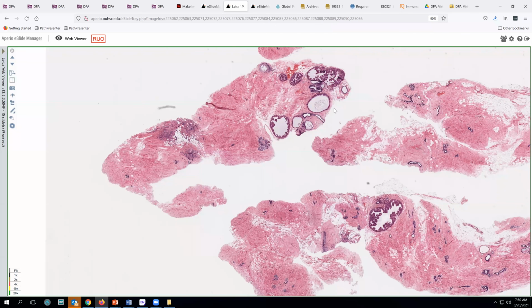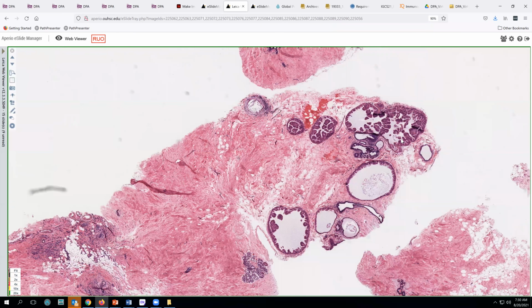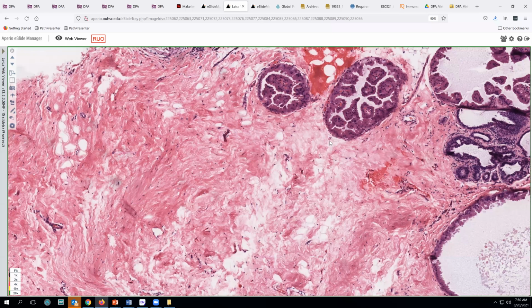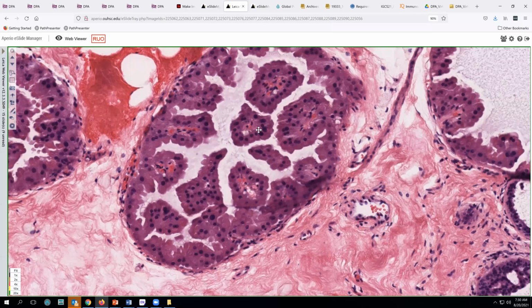So here we see a number of small grouped glands with a little bit of papillary complexity. We see some blue areas. This was a BI-RADS 4 case, and then we see this area where they sort of nipped some blue tissue here. So we'll look at a little higher magnification at this sample, and we can see here that most of this is fairly bland apocrine metaplasia with this nice papillarity and abundant eosinophilic cells, round nuclei, not usually a problem in the diagnosis, but very frequently encountered.